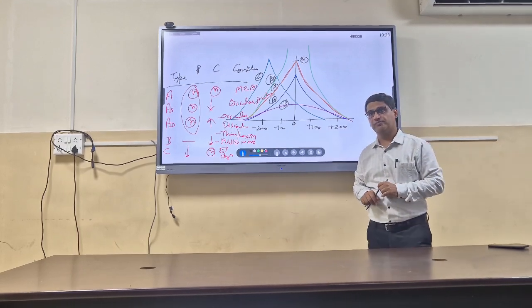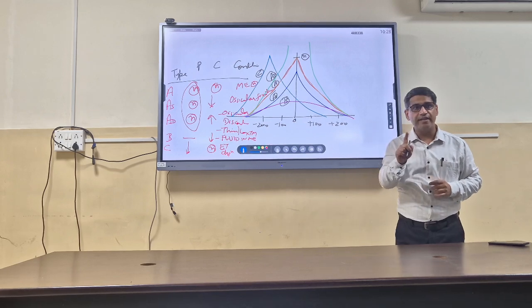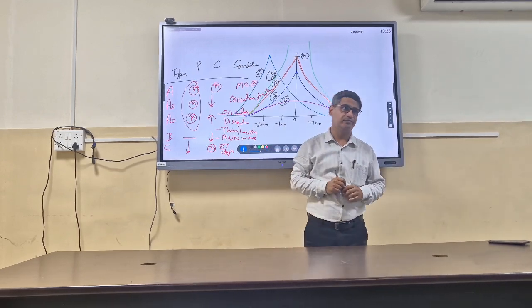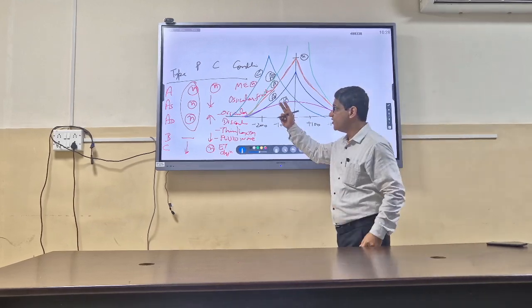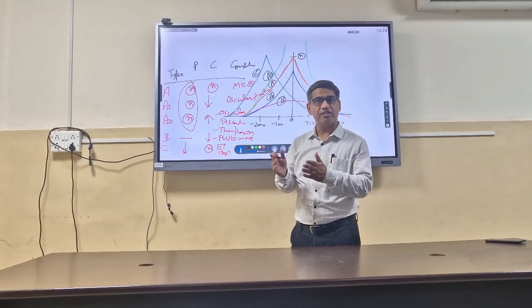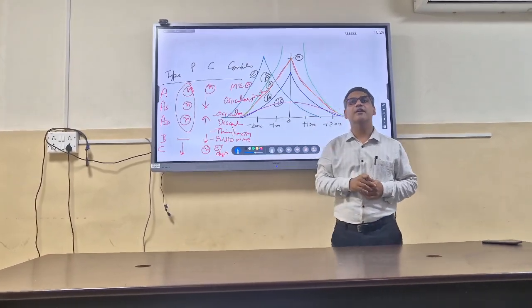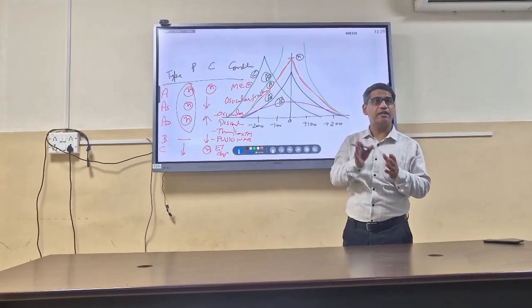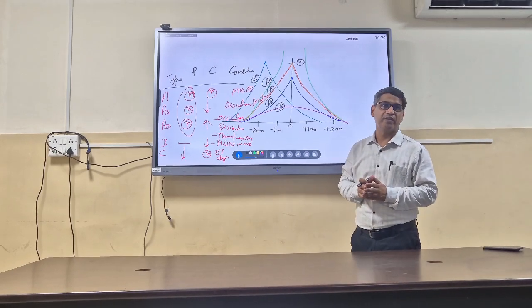What are those? The first thing is that all are causes of conductive hearing loss. And the second thing is that in all these conditions, the tympanic membrane will be normal, or the external ear will be normal. So that was the first condition I told you as the indication of impedance audiometry: conductive hearing loss with normal external ear, that is, normal tympanic membrane.